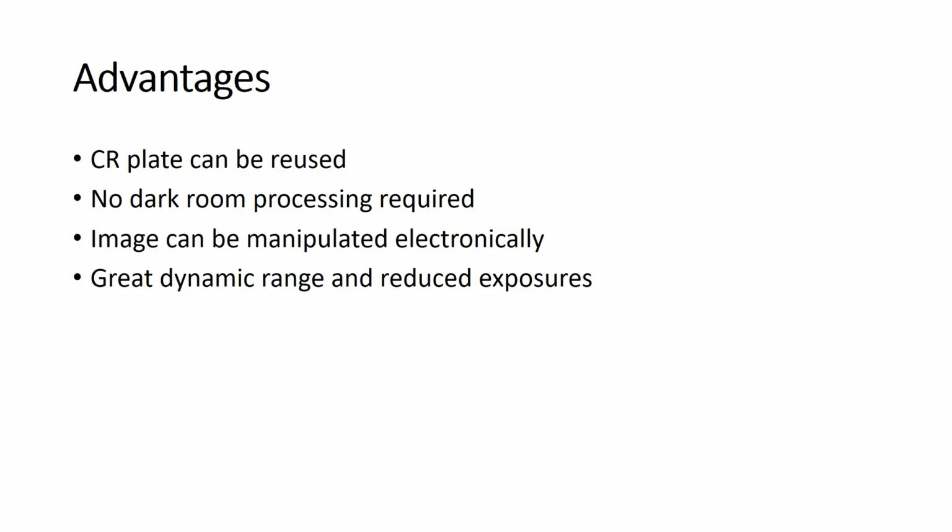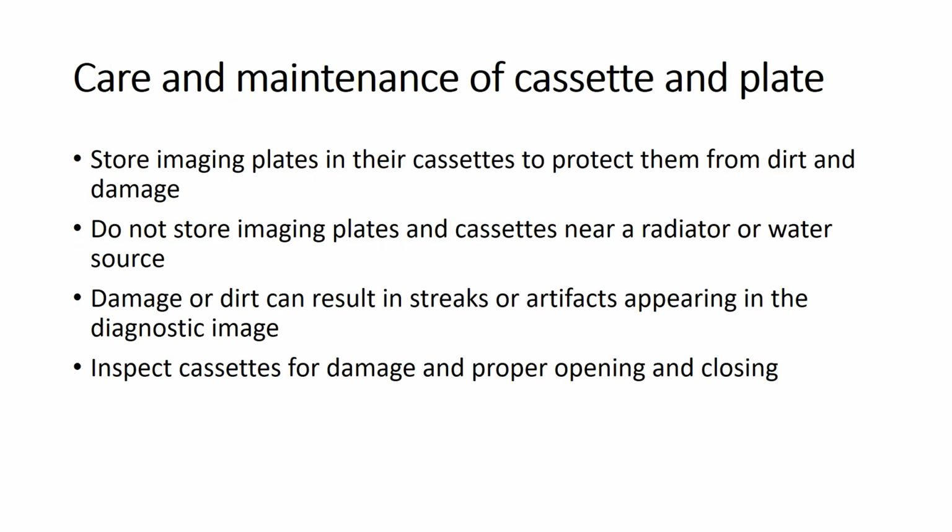That means you can reduce the radiation hazard to the patient, which is a major disadvantage of the conventional radiography system. Because of these advantages, the CR system is more popular nowadays compared to conventional radiography.